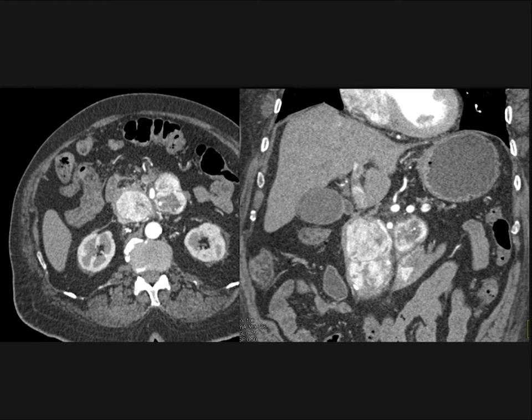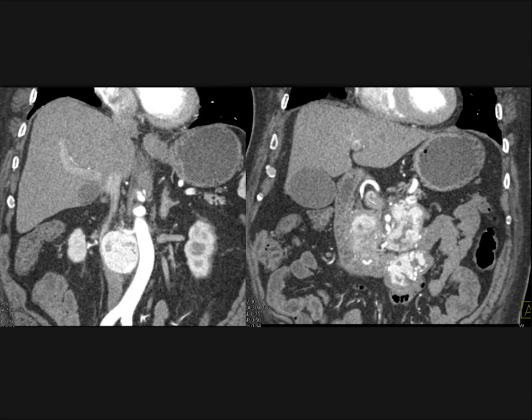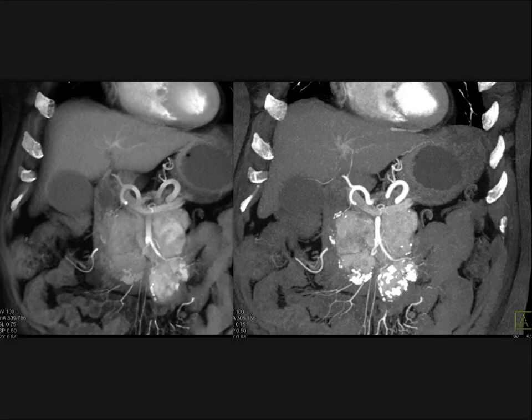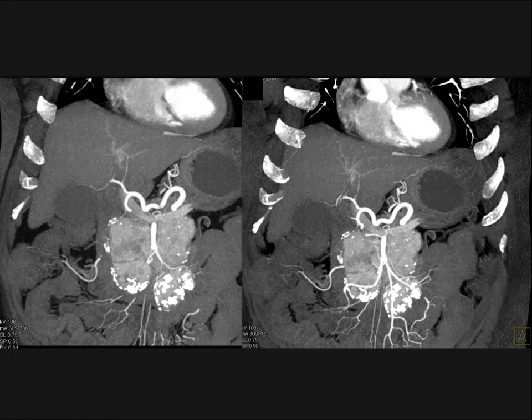There are lookalikes, like there is tumor in the duodenum, but there are so many nodes present. What's going on precisely? Well, if you look at the coronal view here, it's really in the second and third portion of the duodenum that the patient's hypervascular tumor, the neuroendocrine tumor of the duodenum, is, and the rest are very large nodes. I mentioned you can get nodes, but this is the best example I have of large, bulky nodes. You can see here surrounding the SMA. You can see how it extends down toward the root of the mesentery.